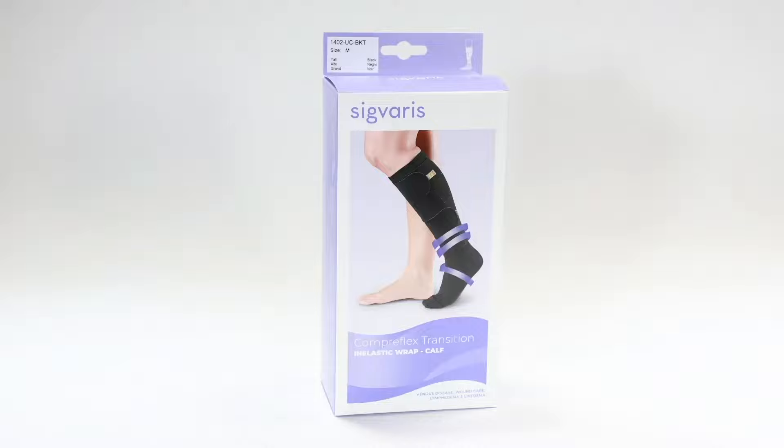Compreflex Transition Calf is a versatile wrap indicated for wound care, including venous stasis ulcers, chronic venous insufficiency, stage 1 or 2 lymphedema, and post-surgical edema. It is made from a medical grade laminated foam material.